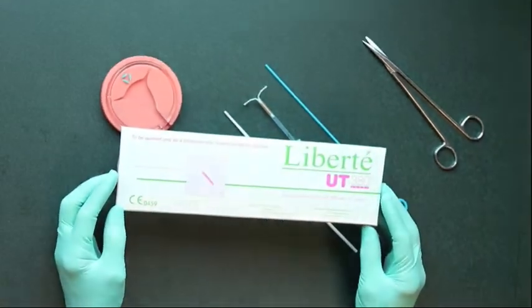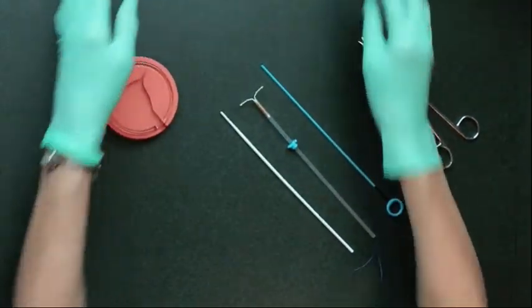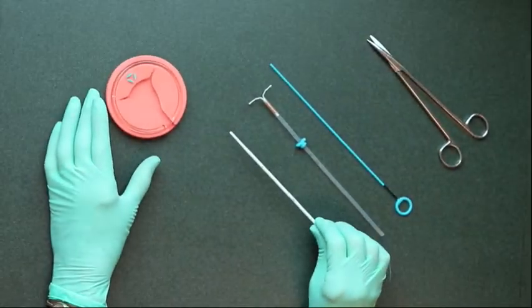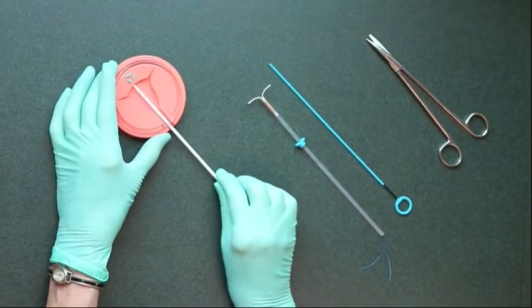This is the Liberty UT380. First, take the sound and measure the inside of the uterus.